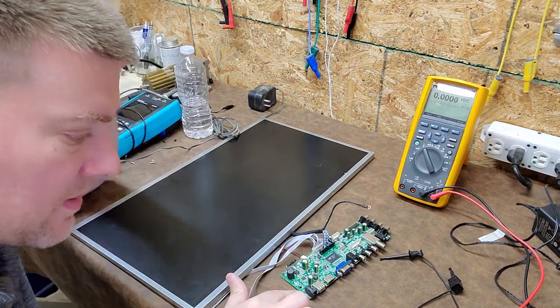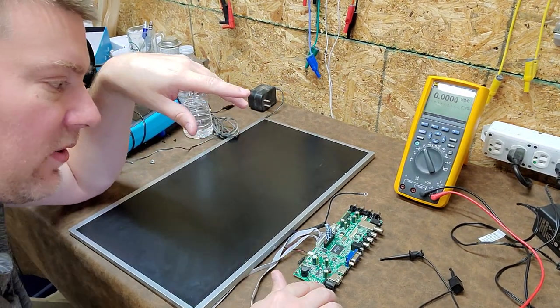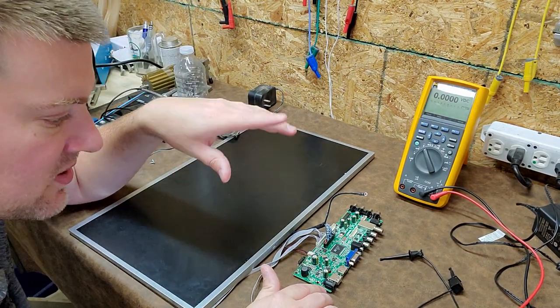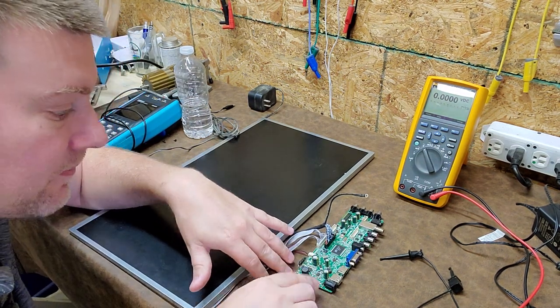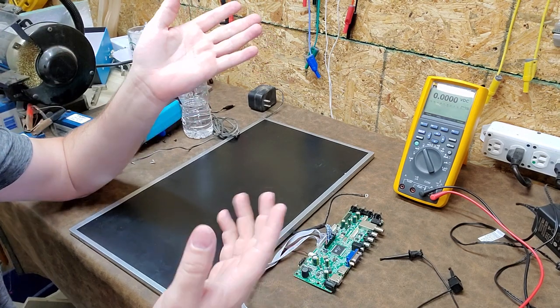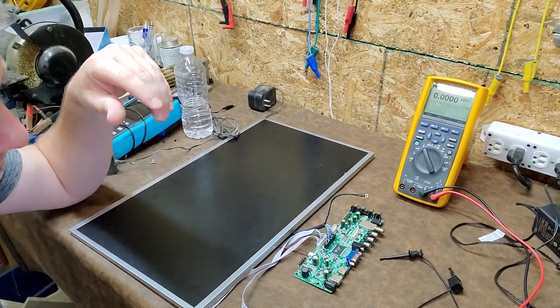There is a main fuse right here. So just like I always tell people, whenever power comes in or goes out of a board, there's always a fuse. And you can see I've got one right here. It does test good. That's obviously the first thing you check. But I think it's ready to power up.